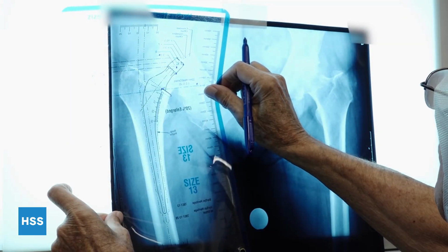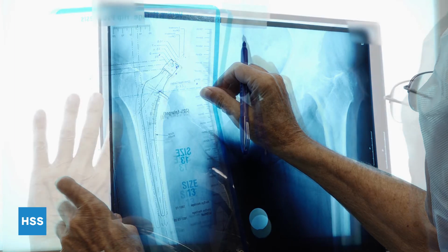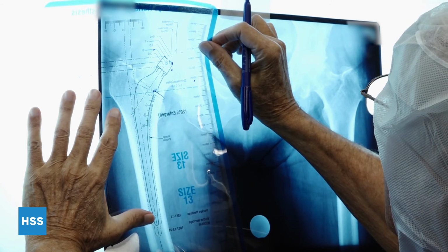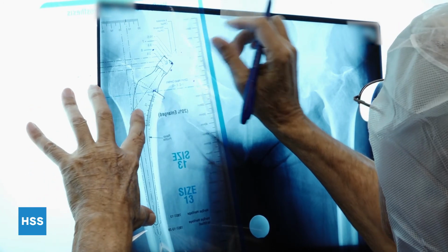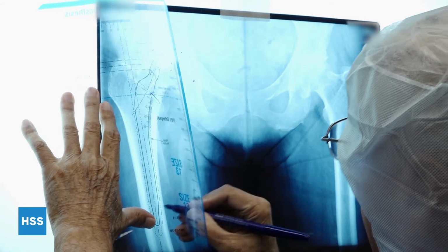For the femoral template, we overlap the femoral template of the proper size to allow preservation of cancellous bone for cement interdigitation. It is placed parallel to the long axis of the femur and well centered in the intramedullary canal, placing the center of rotation on the dot, which compensates for the leg length discrepancy. The location of the femoral neck cut is marked as well as the location of the distal centralizer. In this case, a 13 Versys Heritage extended stem is selected and marked on the adhesive tape.